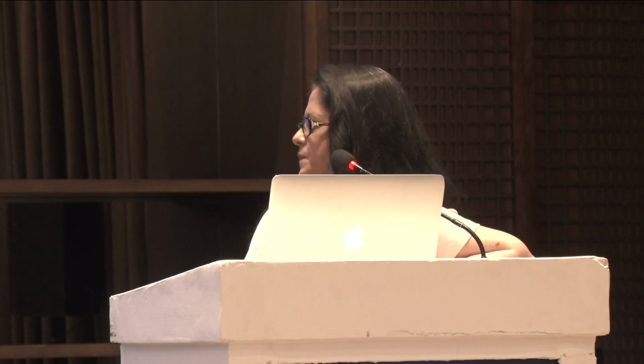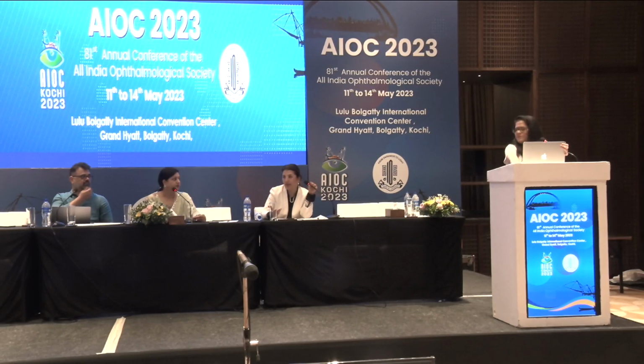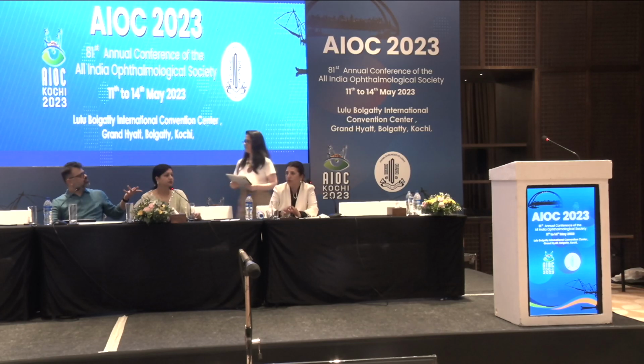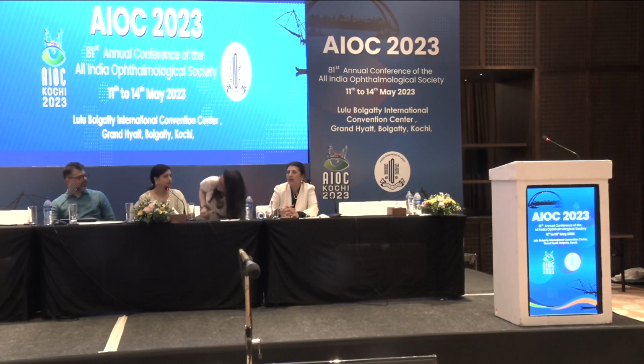Yeah, no, I think you need to include it as part of a possibility, because you have promised them something. But you can tell them, unless you have your own LASIK facility and you're doing a PRK, which is really not costing you much. But if you have to take your patient to another facility, you have to tell the patient that there may be a surprise. And I think, with the kind of biometry we do today with our optical biometers and using the latest generation formulas, refractive surprises are quite rare.